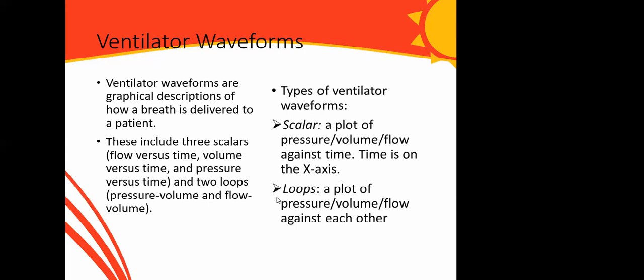Okay, so let's talk about ventilator waveforms. I'm sure that those of us who have seen ventilators and are familiar with them will also be familiar with some waveforms that are displayed even on our anesthetic machine in the theater, not necessarily in ICU alone. Ventilator waveforms are graphical representations of how your assisted breath is being delivered to the patient. You see the waveforms on your ventilator interface.